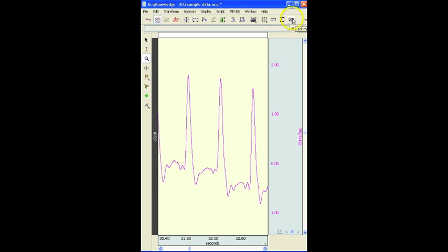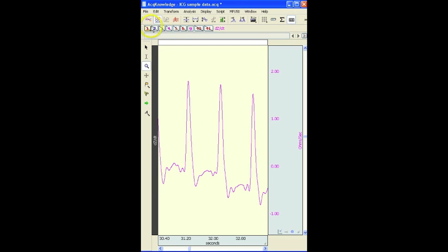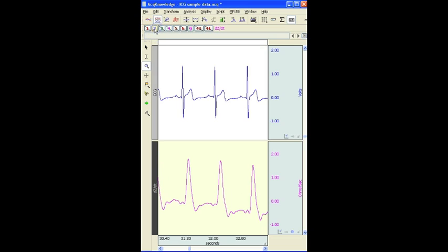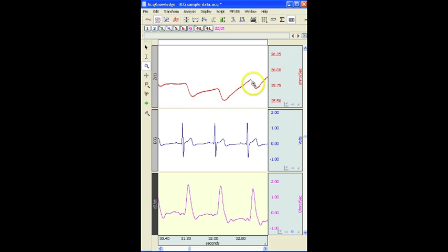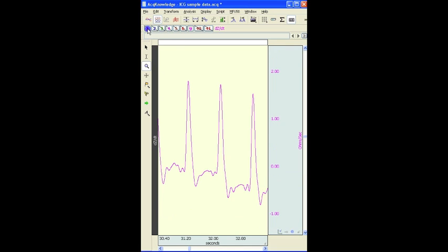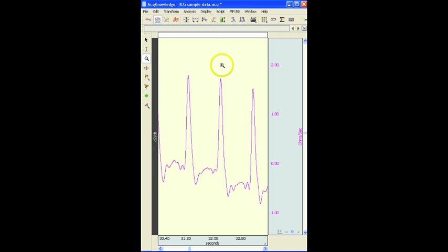If I turn on a couple of other channels, we've also got ECG and this is the Z signal, the raw impedance signal. We don't need these for this particular analysis but I just wanted to point those out. I'm going to hide the channels.